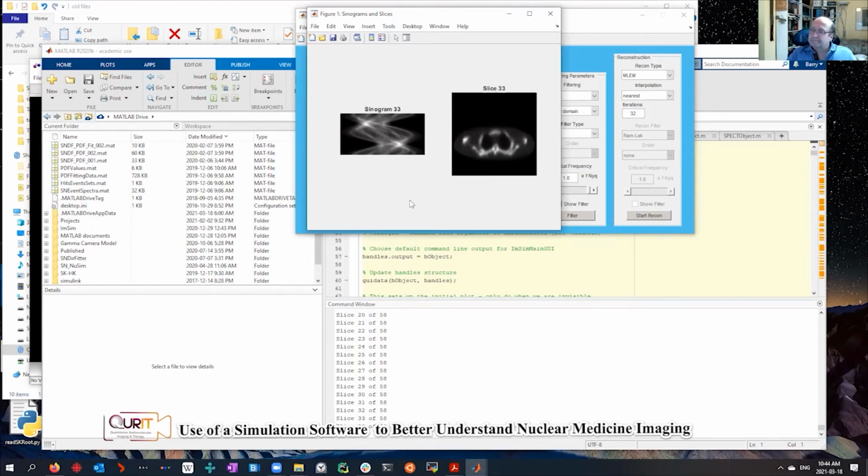Yeah, in fact, OSEM, I've heard it was an accidental discovery. I think it's a 1994 paper. I don't know the exact details of it, but I've heard that somebody just made a mistake in the code, not using the entire data set to do an update, and then suddenly it was actually working quite well, and then the rest is history.